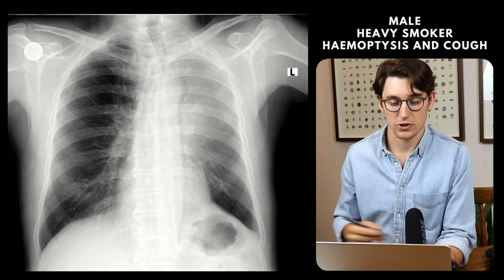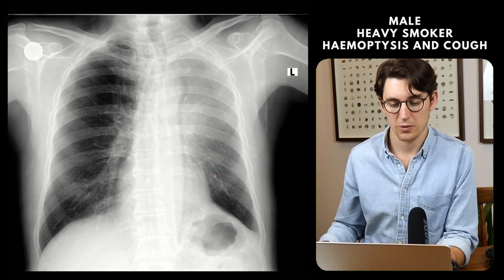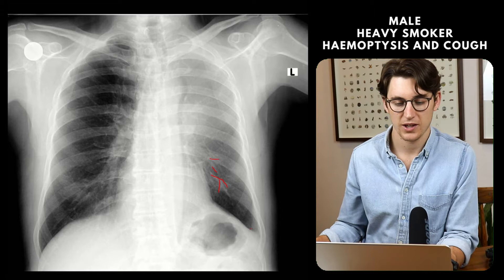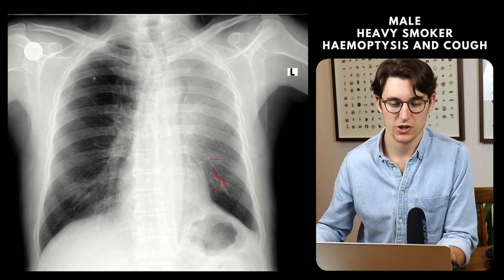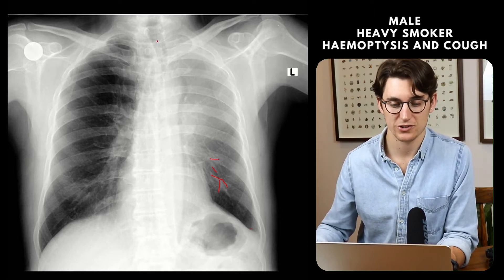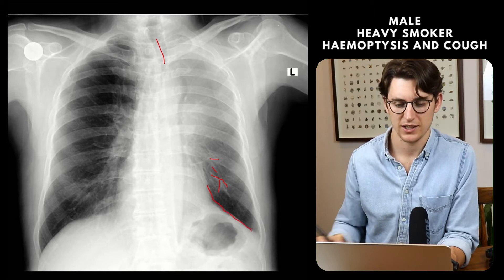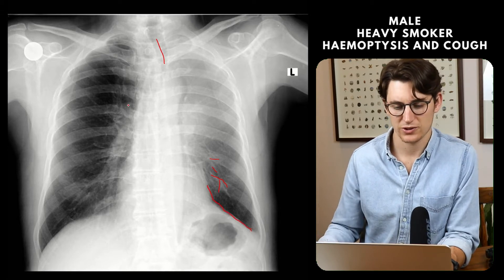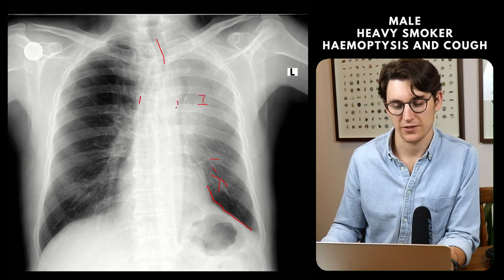The most obvious feature here is this veiling of the left hemithorax with the pulmonary vessels still visible through the opacity. There are features of left-sided volume loss with tracheal deviation to the left. There's a raised left hemidiaphragm with a juxtaphrenic peak sign, as well as rib crowding on the left-hand side and slight mediastinal shift to the left.